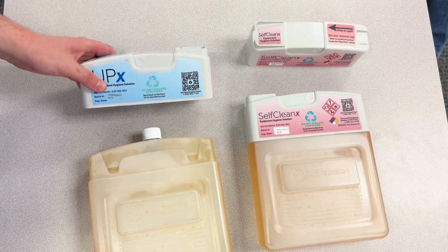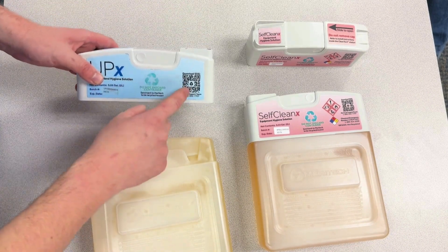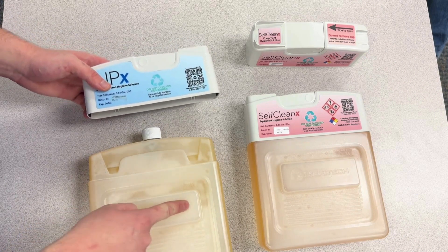When replacing the top, what you're going to want to look for is the recycle sign and the QR code — they should face the side that says Meritec.